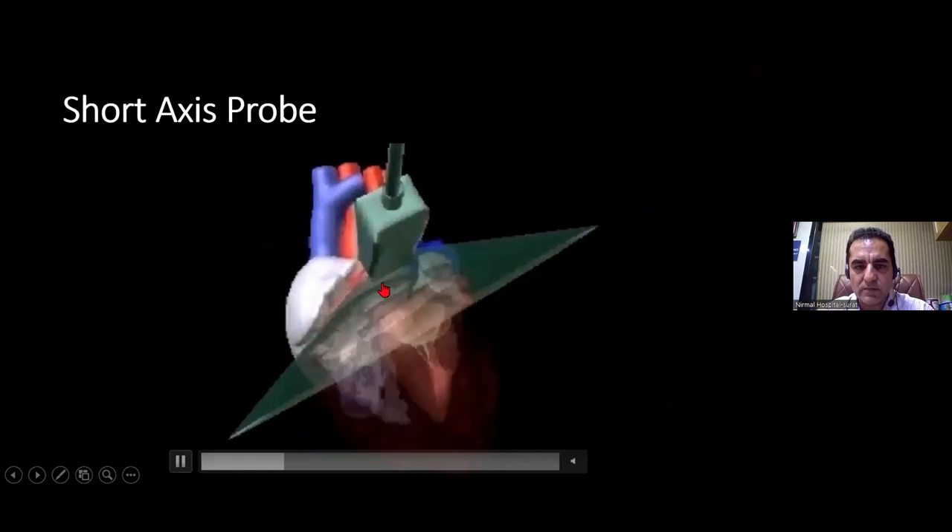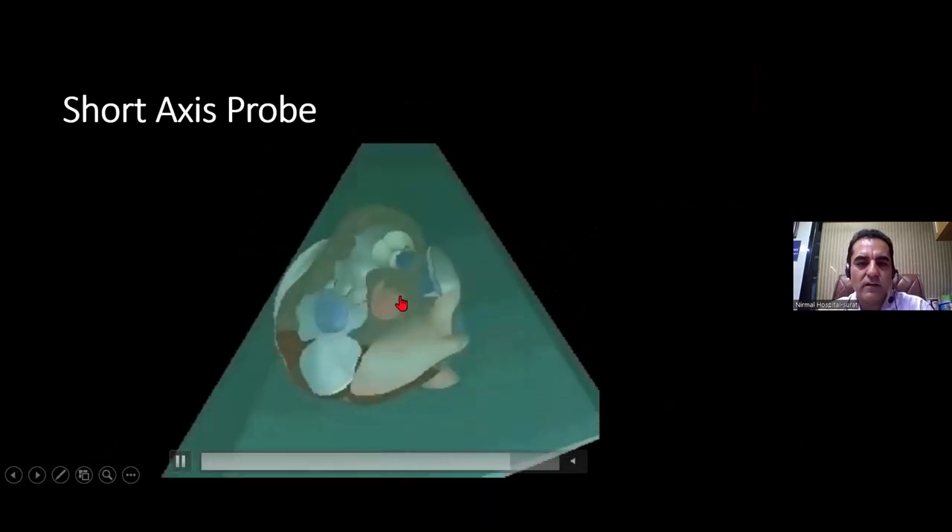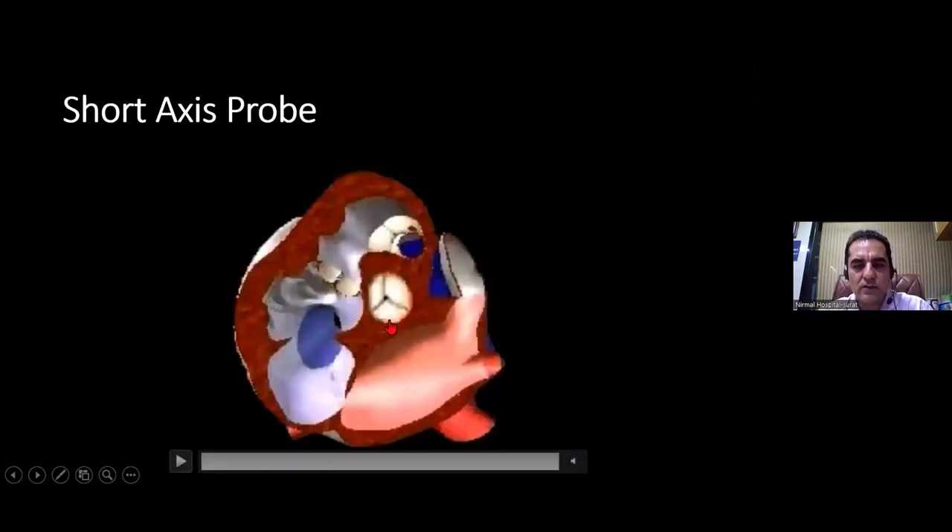The heart is being cut cross-sectionally at the base from where the aortic root starts. The three cusps of the aortic valve are visible, and hence this is known as the Mercedes Benz sign view.